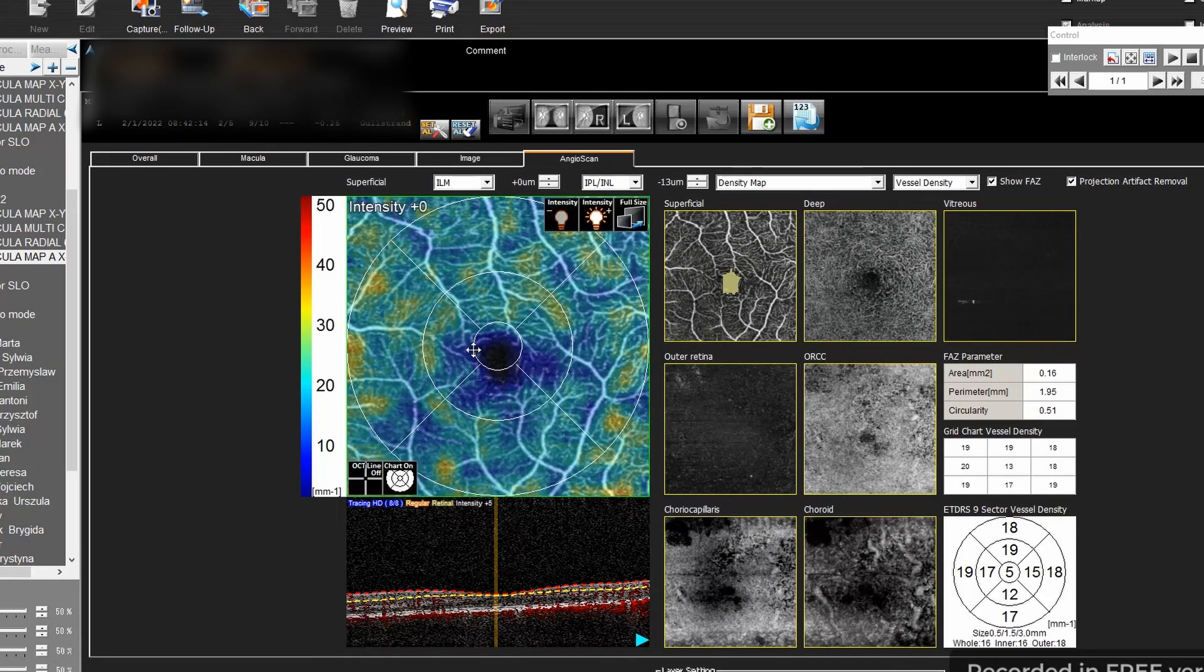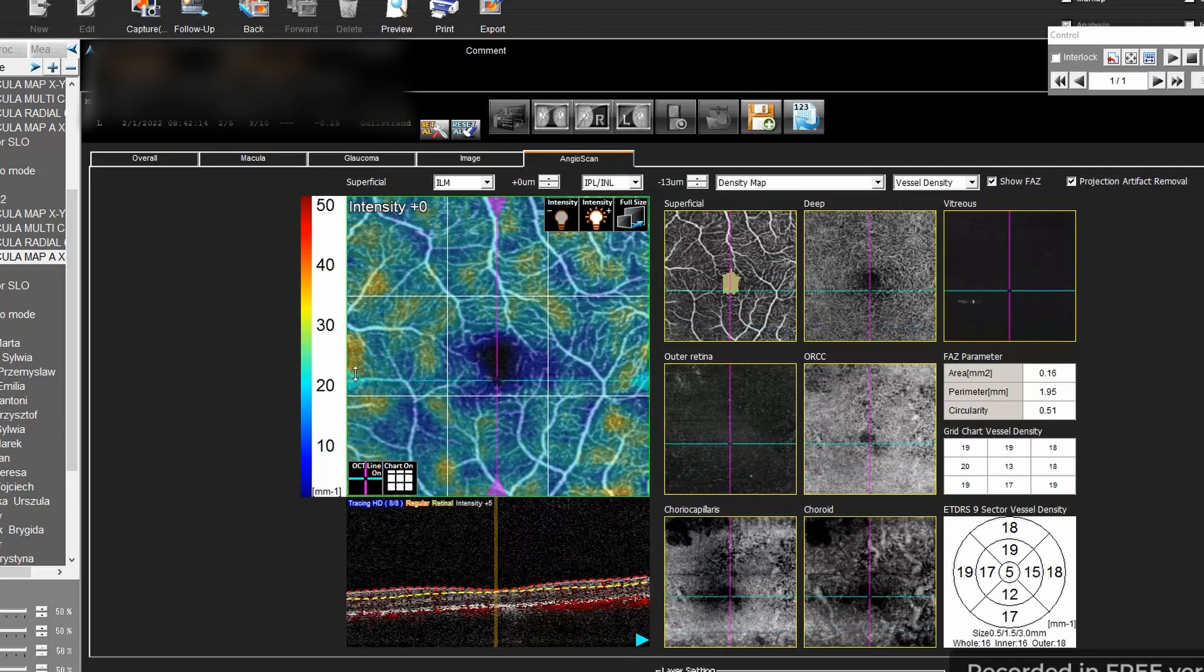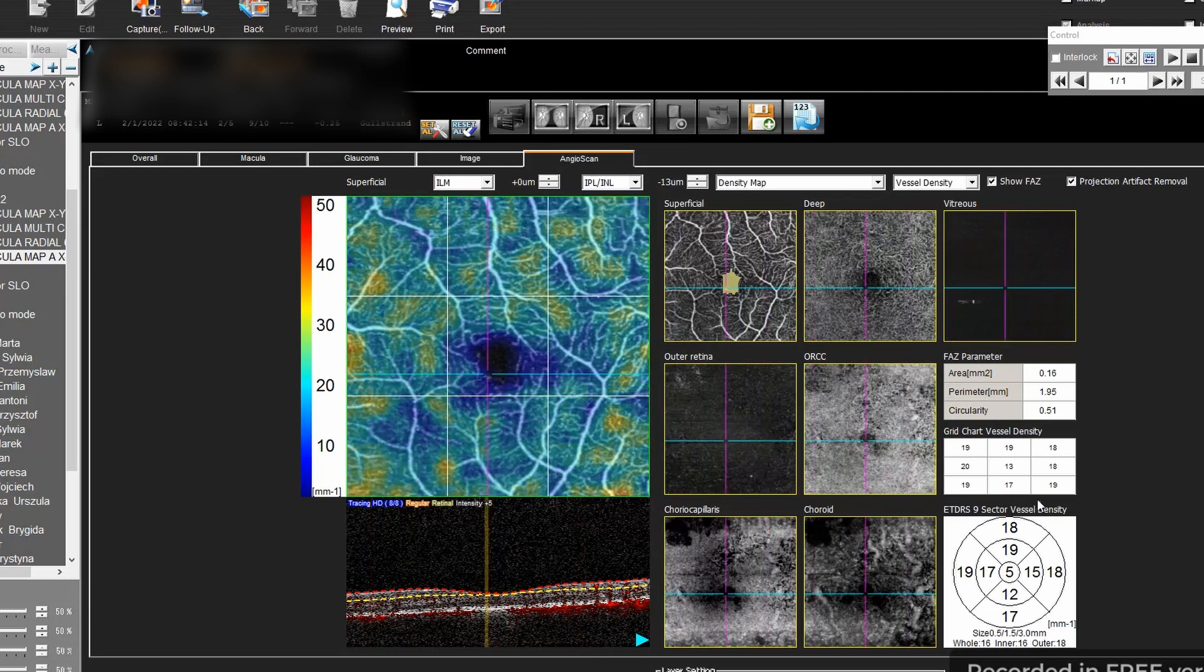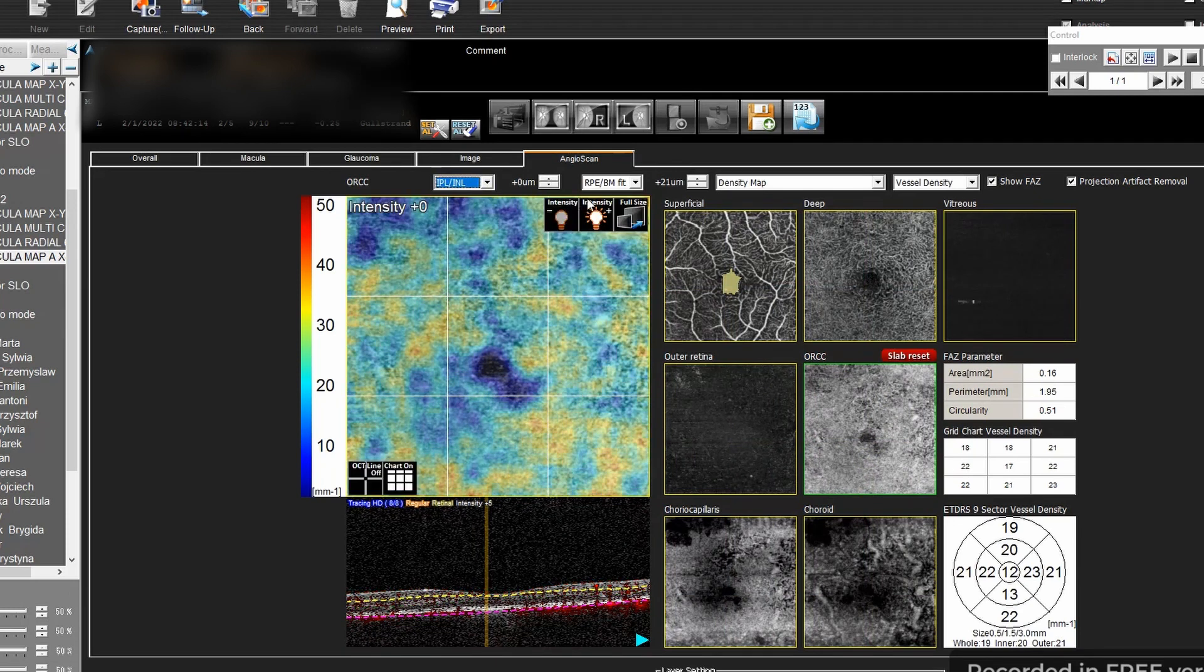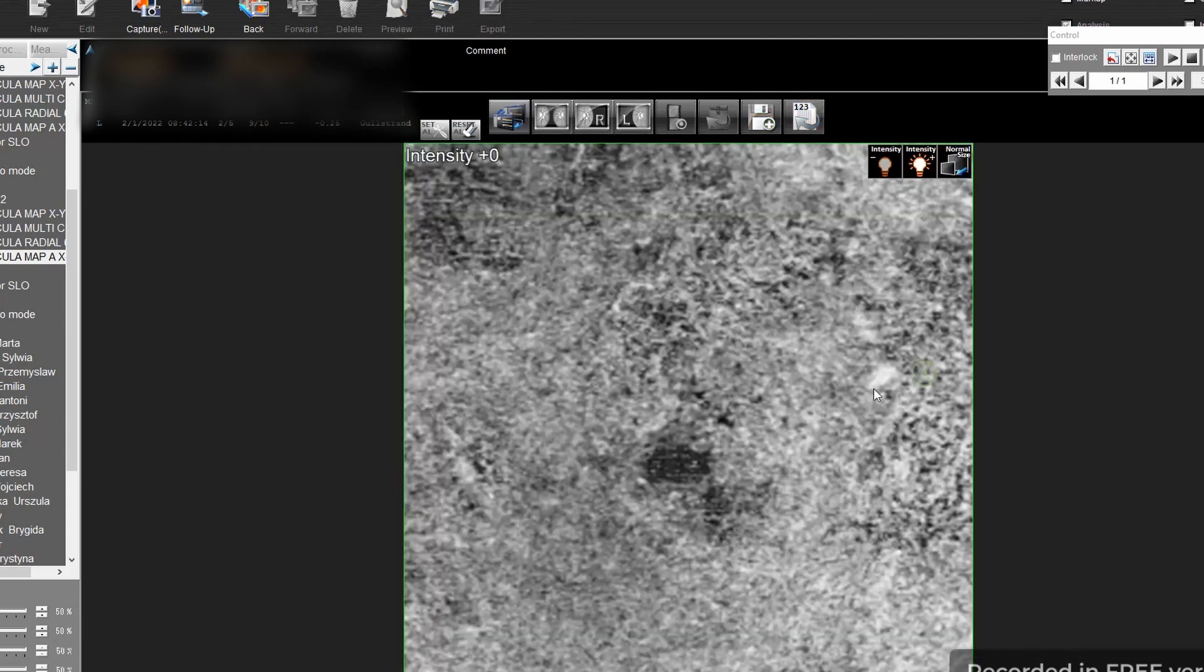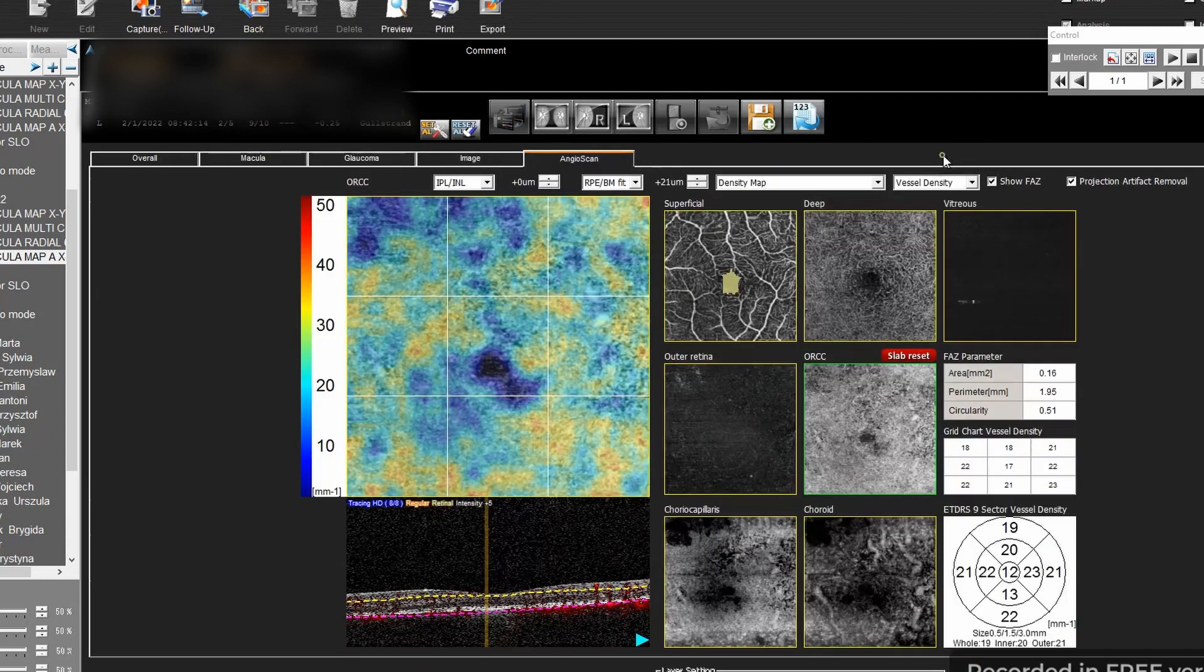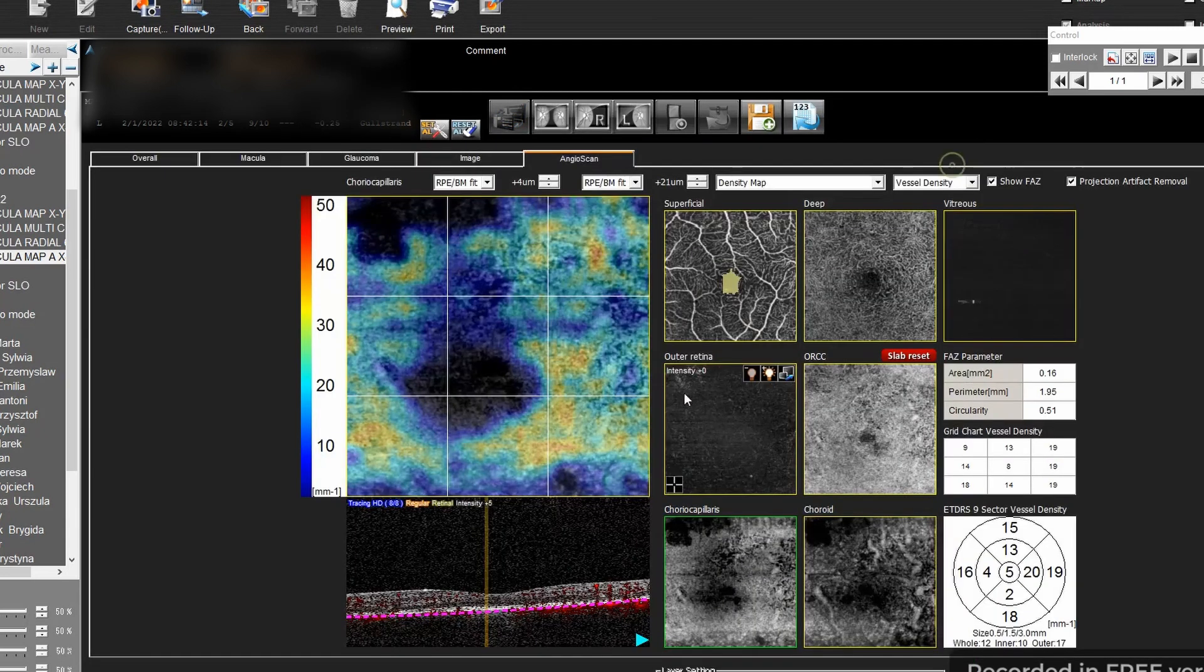Mirante can also capture OCT angiography images but I wouldn't say this is the strongest side of this amazing platform. I would say OCT angiography is not as good as with Zeiss or with Canon devices or with OptoVue. It still lags behind those machines and the resolution isn't good, then you have plenty of artifacts. So I would say OCT angiography still needs improvement.